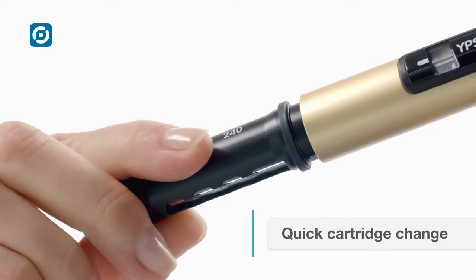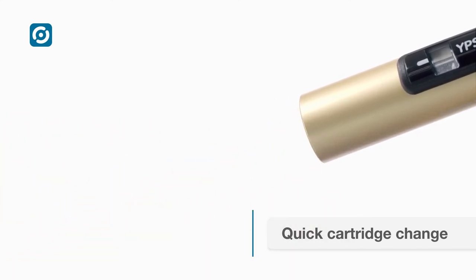The cartridge holder with bayonet connection makes cartridge changes quick and easy.